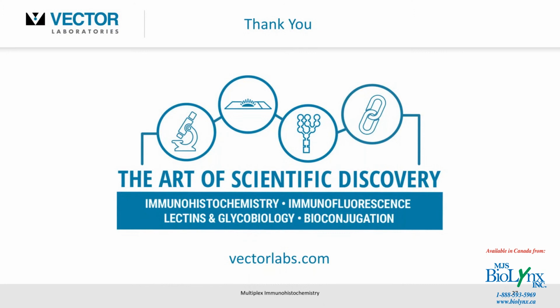You can do that with chromogenic multiplexing. You can't do that with immunofluorescence. It's gone the way of the dodo. It's faded out. It's lost its crispness. It's dissipated from the site of localization. Potentially after weeks or months, you're going to have to repeat that result, and that might be problematic for a lot of reasons. So I would say that would be one certainly significant advantage of using chromogenic multiplexing over immunofluorescence.